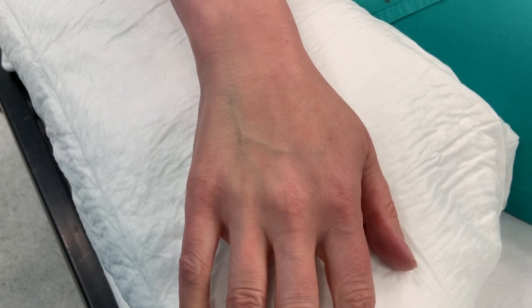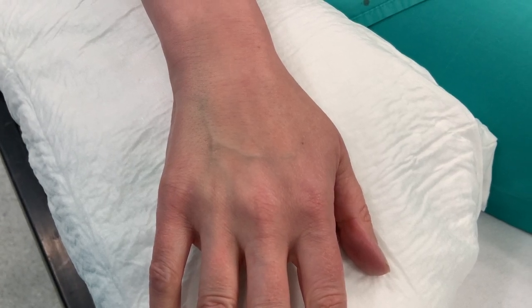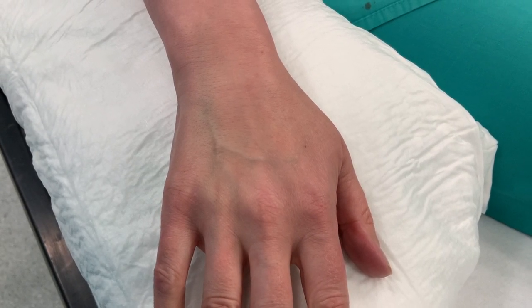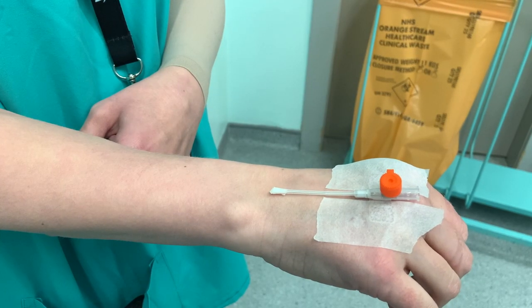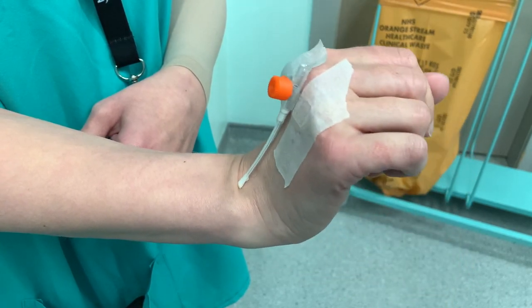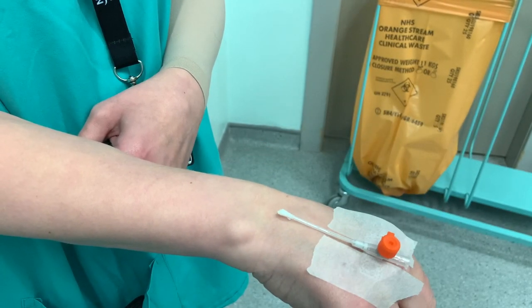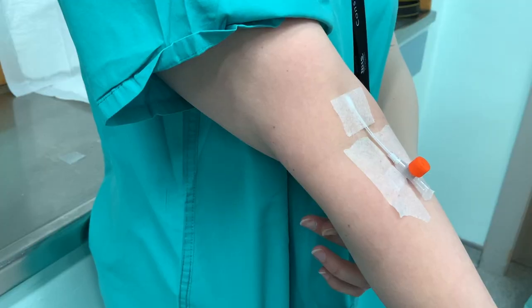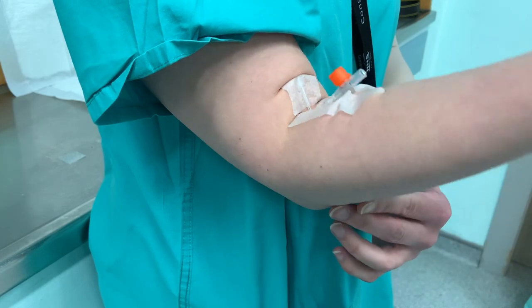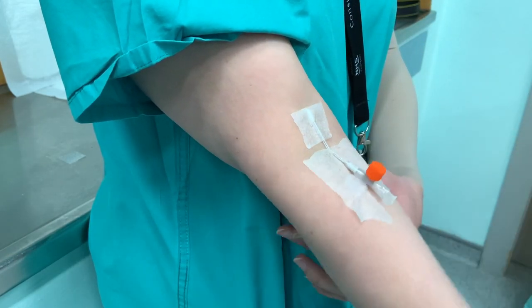Maximise your chance of success by picking the right vein: you want one that's fairly long, straight, with minimal junctions, and big enough to accept the Venflon you're planning to use. Ideally avoid inserting across a joint such as the wrist, since flexion and extension will cause discomfort and injury to the vein. The elbow is notorious for causing kinking of the Venflon every time the patient bends their arm.